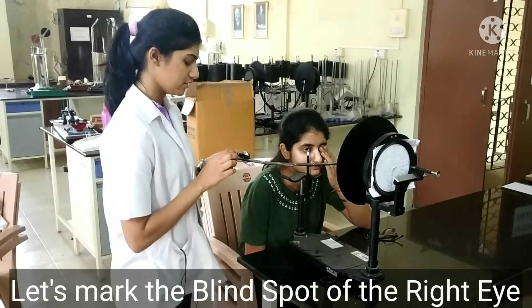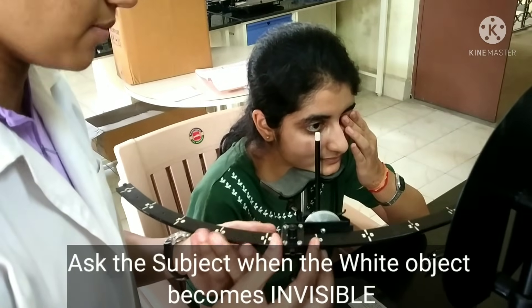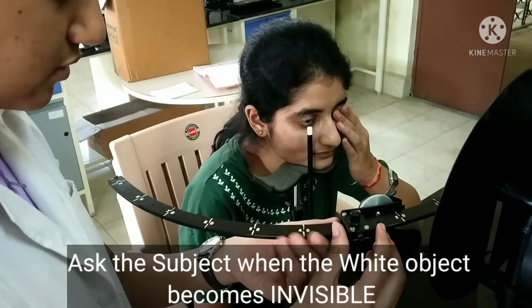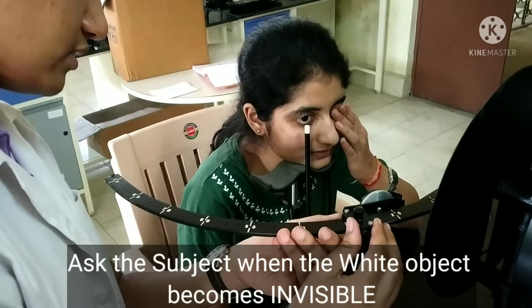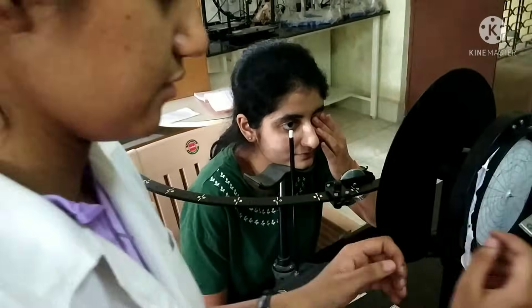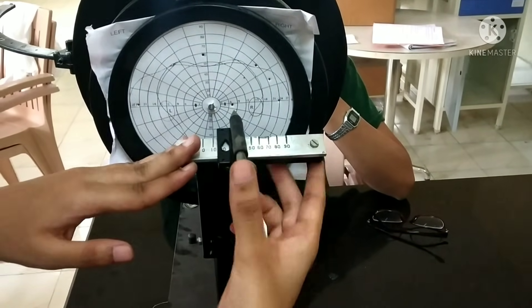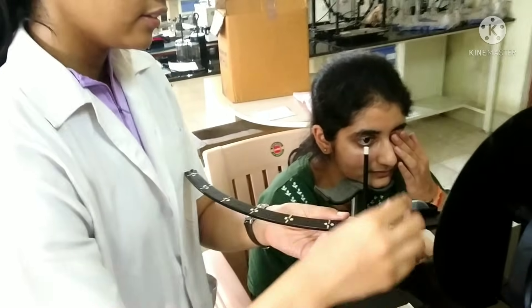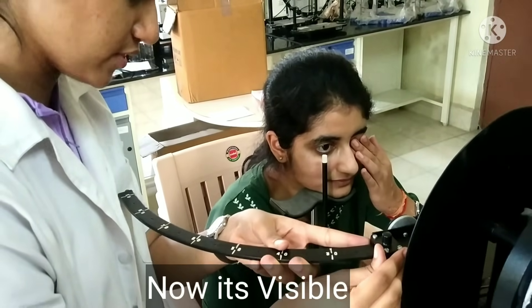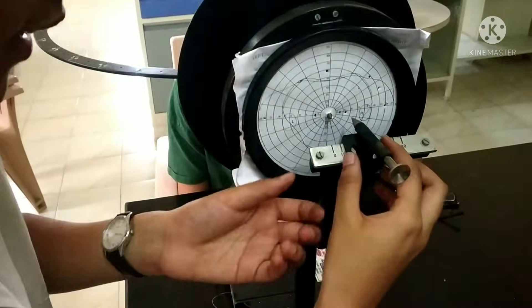Now let us map the blind spot for the right eye. We ask the subject to tell us when the white object becomes invisible. Moving slowly, the object becomes invisible at a reading of 25, which we mark. Then we continue and the subject indicates when the object becomes visible again — the reading is slightly ahead of 20, so we consider it 20.